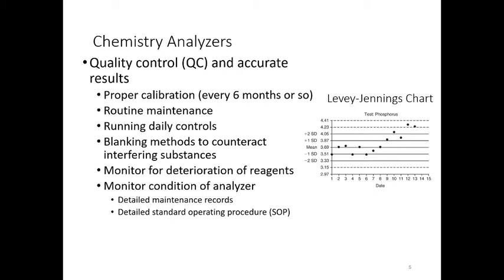We want to make sure that we're monitoring the condition of our analyzer. To do that, we want to keep maintenance records and have standard operating procedures. If you walk into a clinic and note that they don't have quality control for their machines, don't have a standard operating procedure, and nobody has taken accountability and responsibility to take care of that machine, that is one area where, if you feel comfortable stepping in, I would highly recommend that you do so. A lot of people say, it's a machine and it's just going to run until it breaks down, and then we replace it. It's just not the case. We need to make sure that every single day it's giving us a correct result.